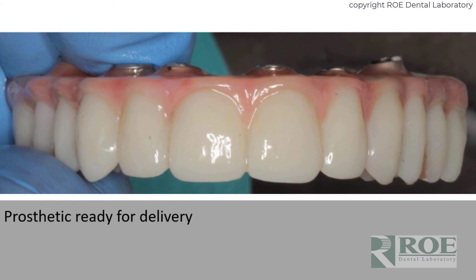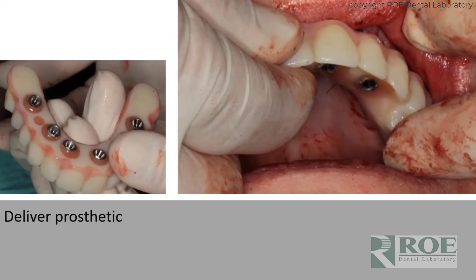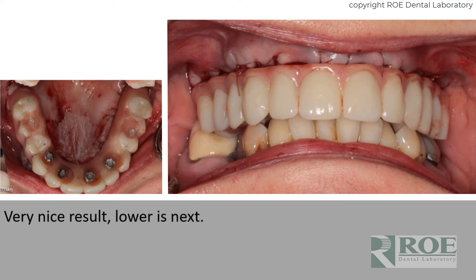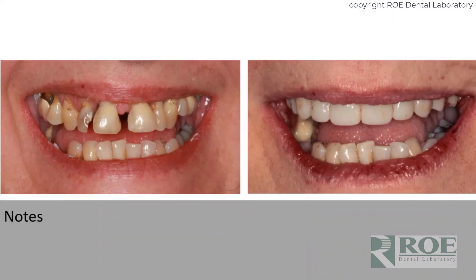The prosthetic is ready for delivery. While the prosthetic was being converted, the fixation base and pins were all removed. The patient was sutured, and comfort caps were placed. Now the prosthetic is delivered, screwed down, equilibrated, and the holes are filled with flowable. It's a very nice case — we also made an opposing bite proof to idealize the occlusion, as the patient has a future Chrome on the lower. Thank you, Dr. Weijin Lee, for sharing these images. And that is Chrome Guided Smile in a single arch dentate situation.